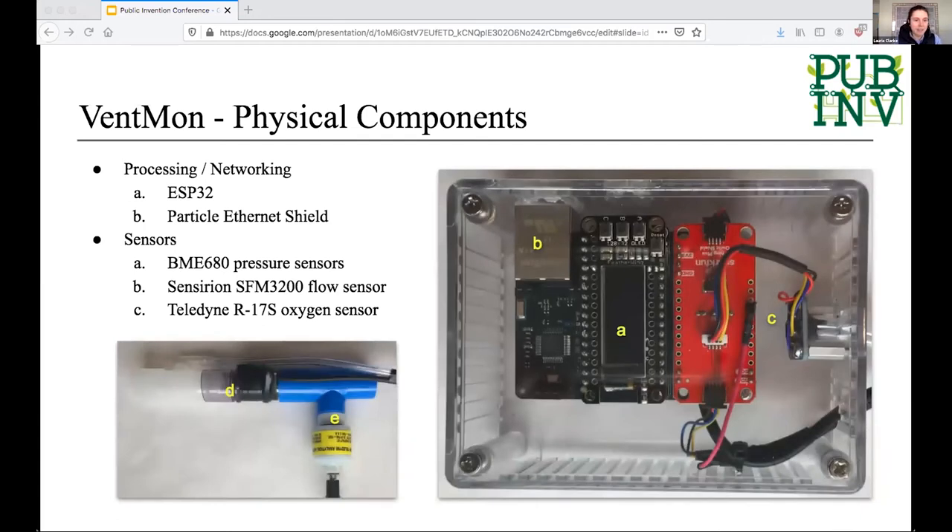This is a look inside the box of what I think is the second iteration of Ventmon. To handle all the processing and communication between sensors, we used an ESP32 microcontroller connected to an Ethernet shield made by Particle Labs. An additional shield allowed all the sensors to be connected via an I2C bus. The data generated is quite small. The pressure sensors were a particular type of Bosch pressure sensor, and we used a variety of Sensirion flow sensors. For oxygen sensing, we used a sensor from Teledyne — actually a sensor you'd find in a dive shop, which was kind of cool.